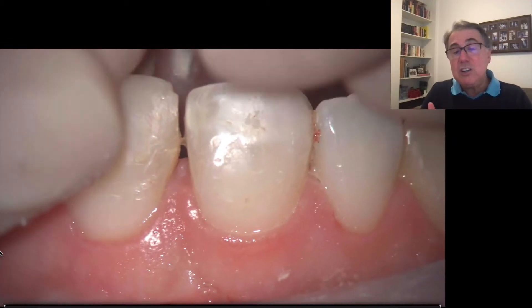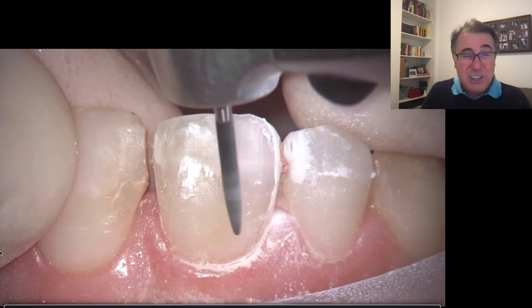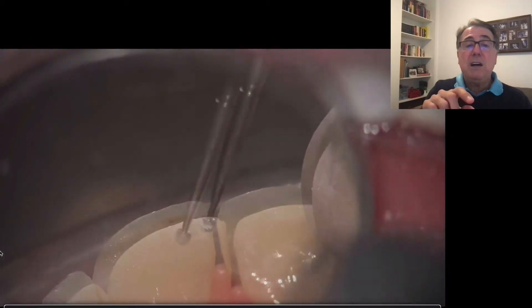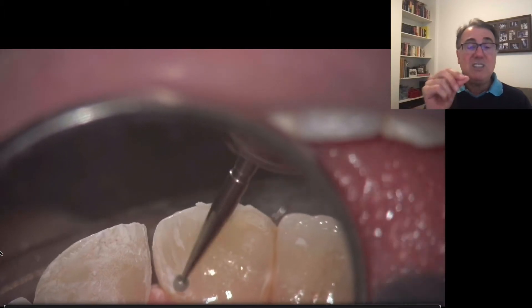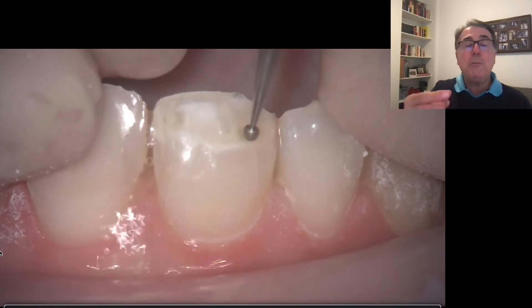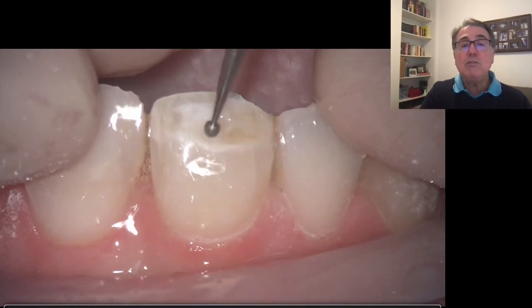We can do that easier than removing a ceramic veneer, but still it's very tiresome, very tricky, and it takes a really long time to remove everything. What you see there — that's not caries, that's not secondary caries or anything — that's just a stain between the two layers of composites on that tooth. So we're removing everything, because I don't want to do my new restoration on top of the old composites.